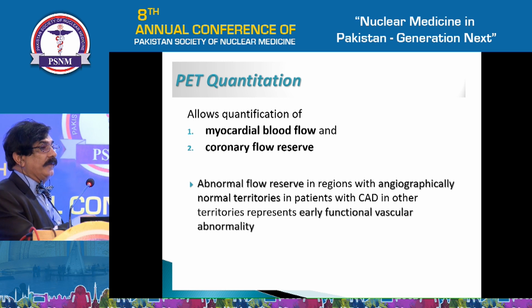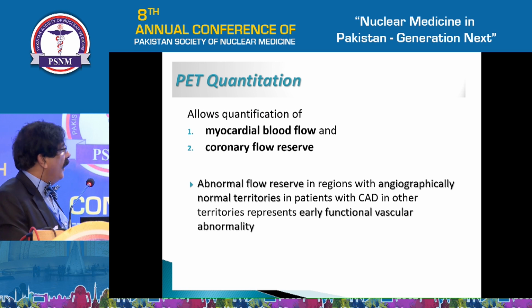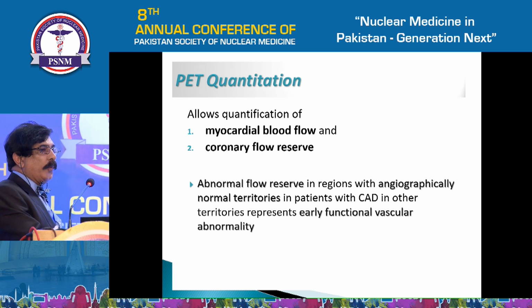PET quantification is a new thing, and it allows quantification of both the myocardial blood flow and the coronary flow reserve, and this is really very important in differentiating macrovascular coronary artery disease from microvascular coronary artery disease.